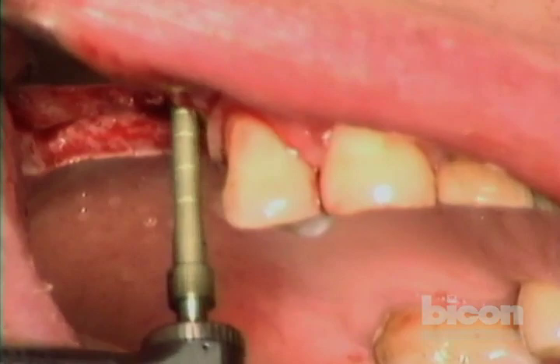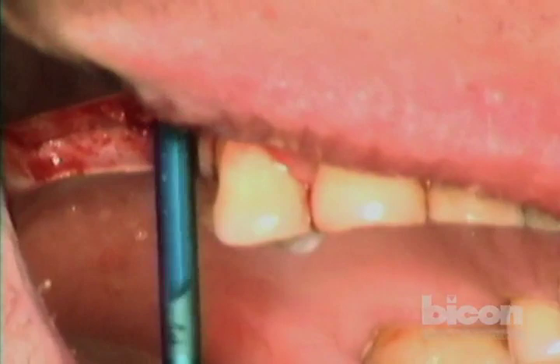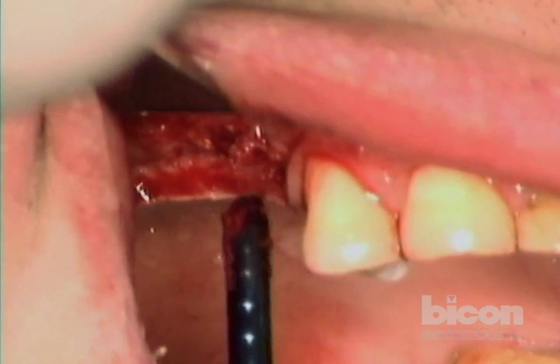We are using the medium-length latch reamers. I'm at six millimeters and just beyond — not much bone coming out yet. Because the socket is mostly loose osteoid and bone graft, the osteotomy is going to be transposed distally, so where our pilot hole was is actually not the center of the implant — it will be the mesial edge of the implant. This works out fine and gives us good spacing from the mesial tooth, number five or 14.